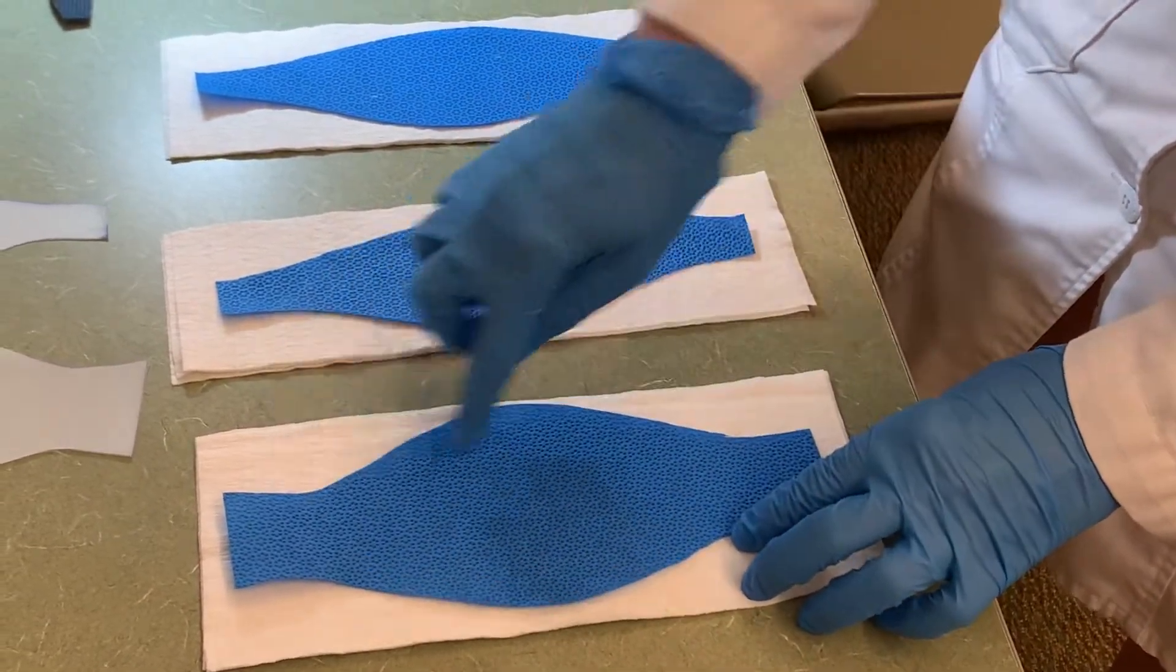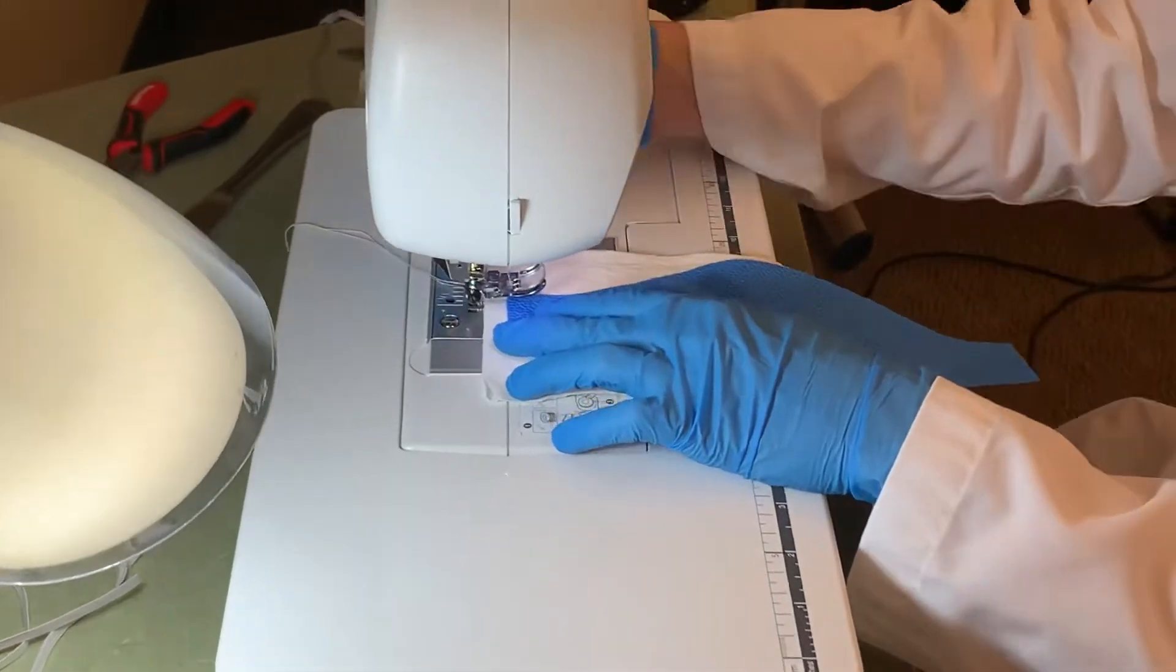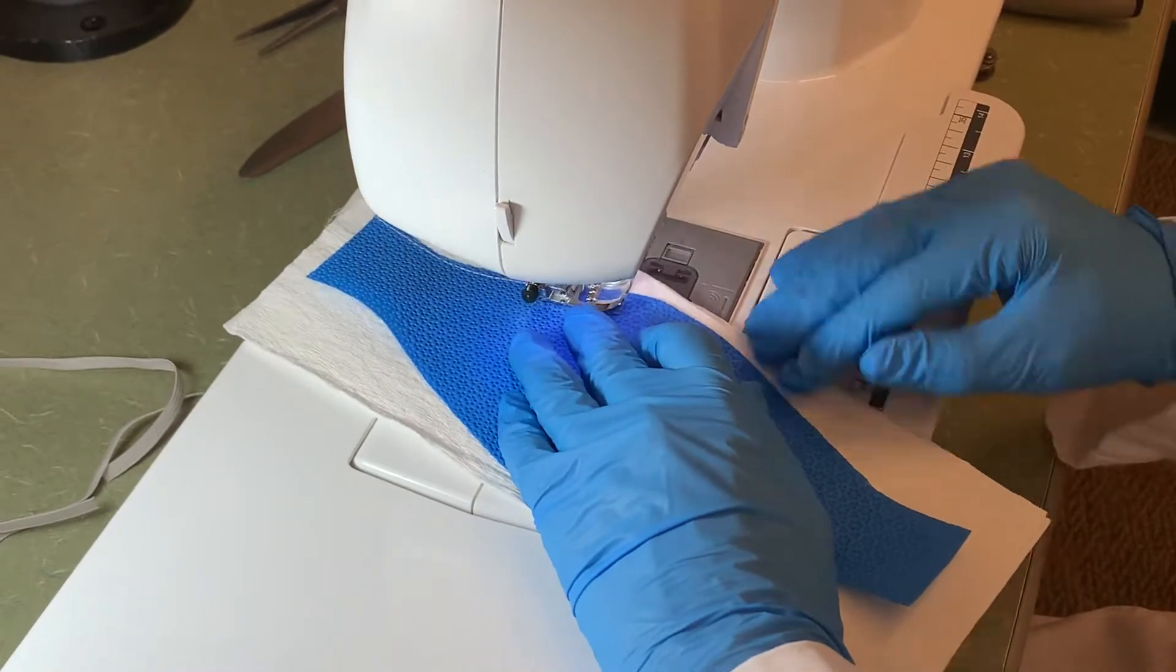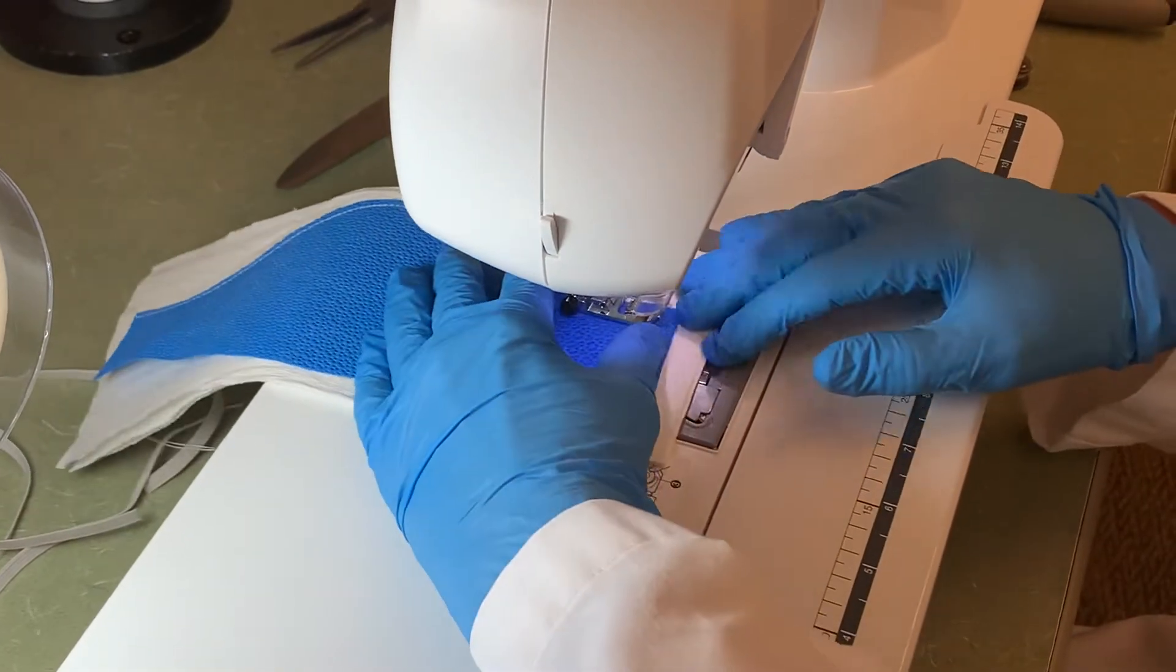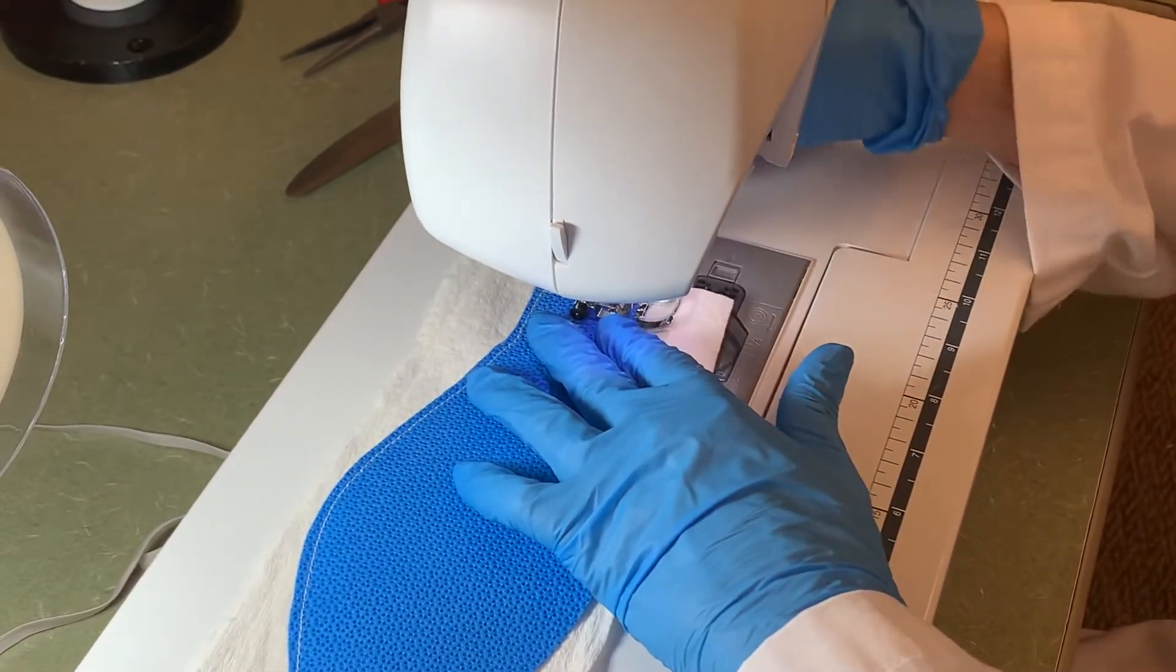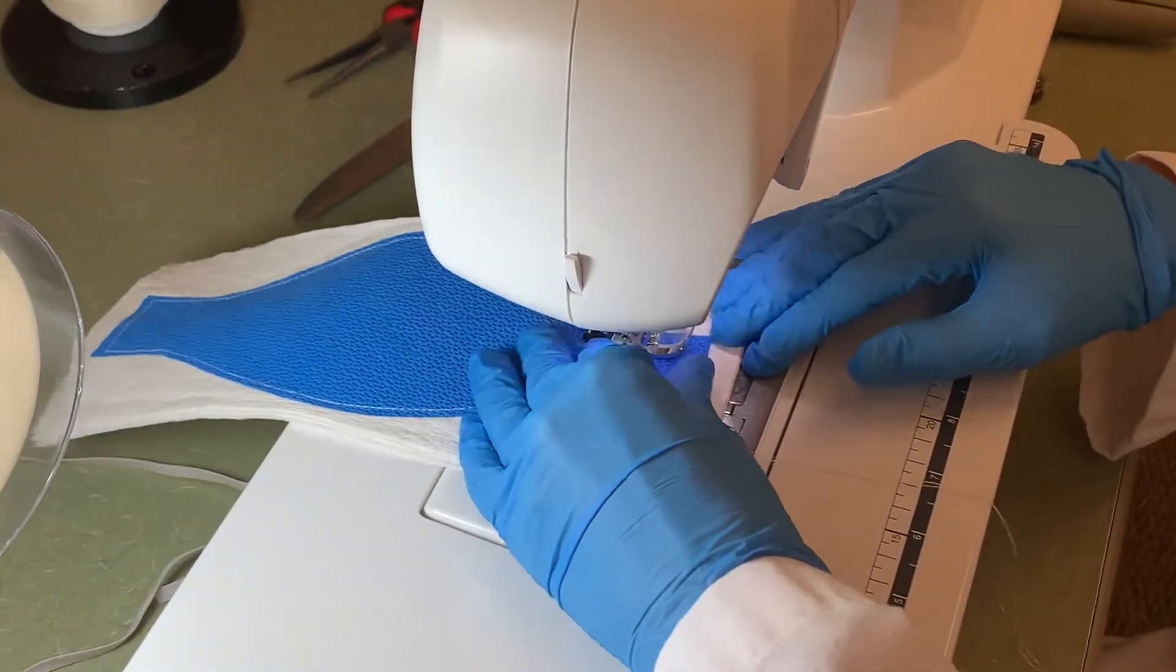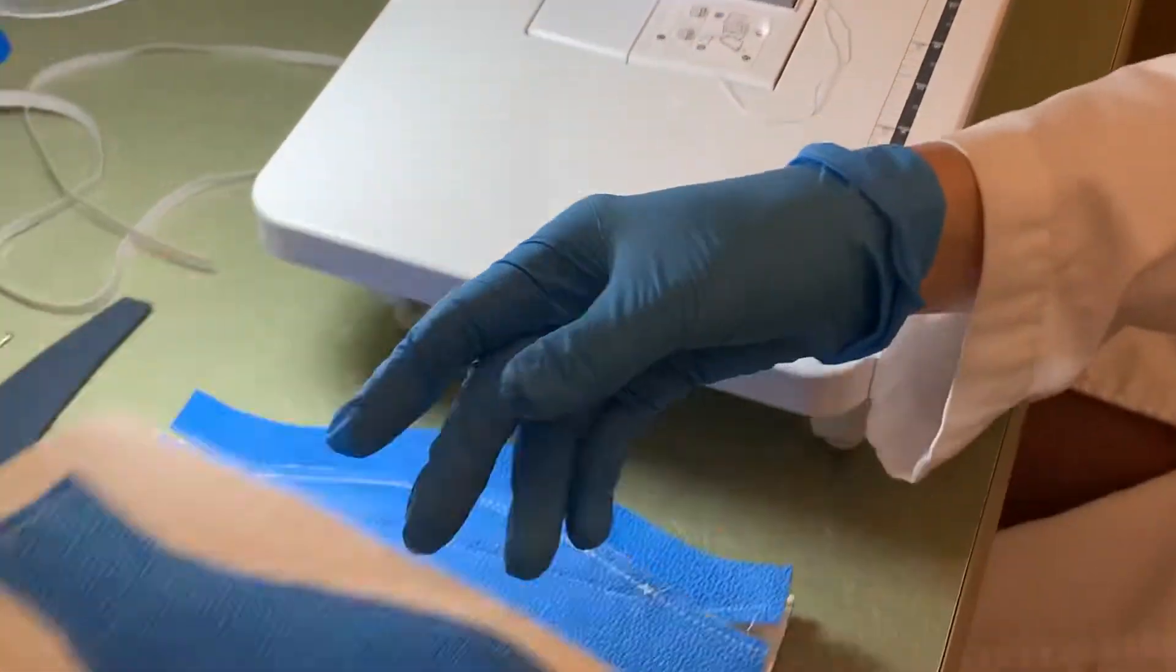The first thing to do is to sew around these. So we take this one, bring it to the sewing machine and we're going to stitch around the edges. Rotate and rotate again. And there's no need to backstitch because you're going to be stitching across that. That's how you do that piece.